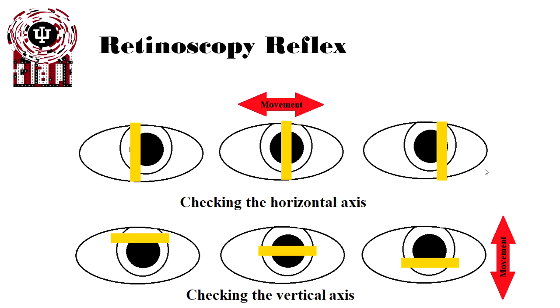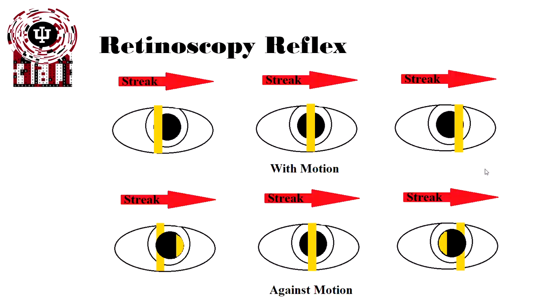When we're measuring the vertical axis, the orientation is actually switched to the horizontal, so that the retinoscopy light is actually imaged horizontally, but we are sweeping vertically. And that's true if we're measuring off axis too, at oblique or 30 degrees. The orientation of the beam is 90 degrees away from the sweep. So we're sweeping 90 degrees away from the axis of the retinoscopy.